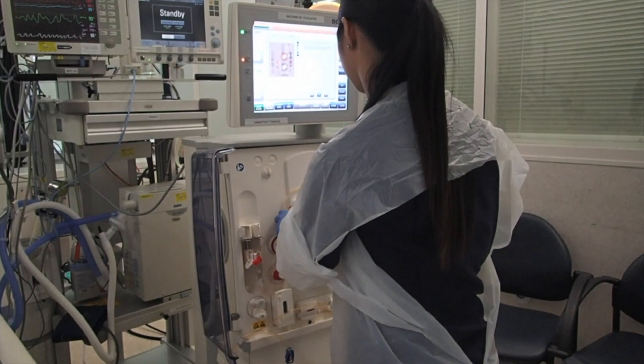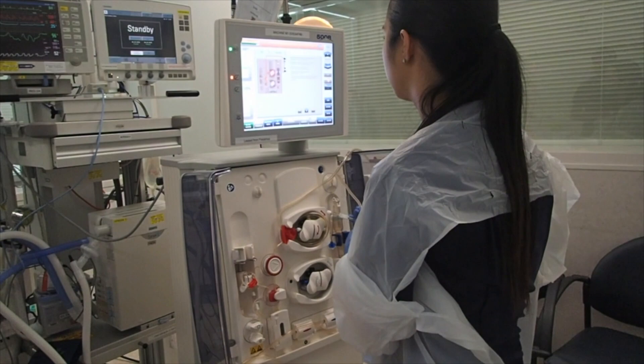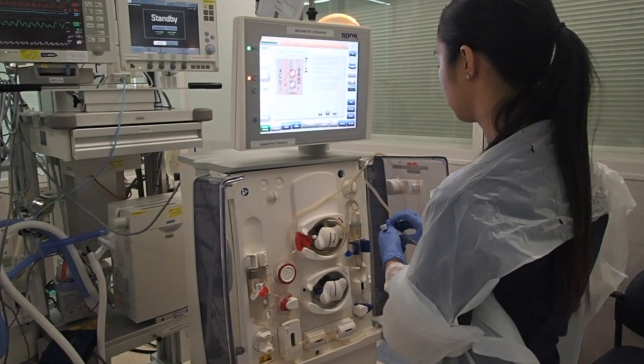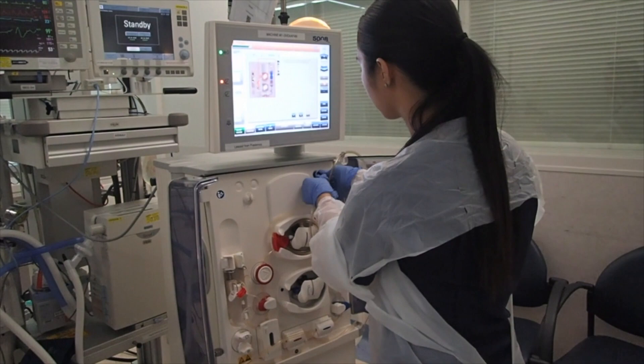The access line in the blood pump had to be reinserted as the machine wasn't showing the instructions on the monitor. Now, on the top of the return line, there is a little line that goes into the return pressure. This port will now read the venous pressure.